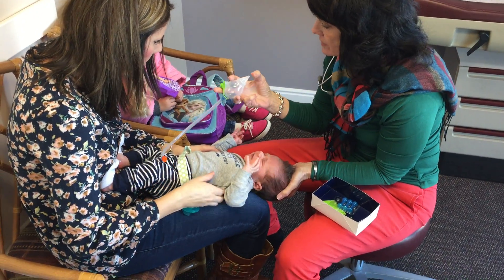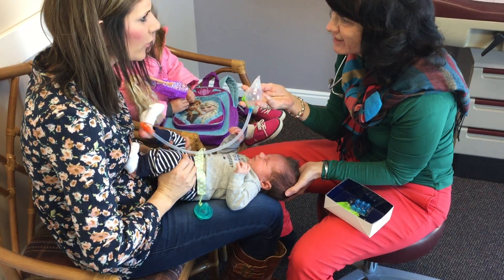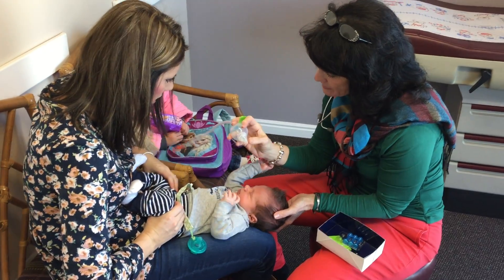I really like this tip because it's a lot softer — not like the other ones they come home with from the hospital, which are a little hard. This one's really soft and kind of flexible.